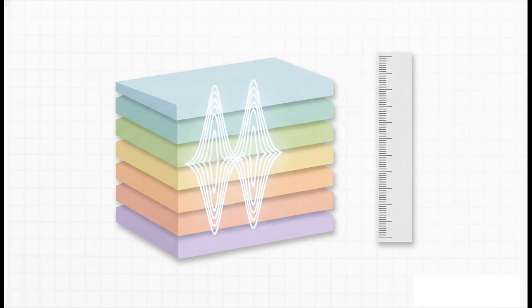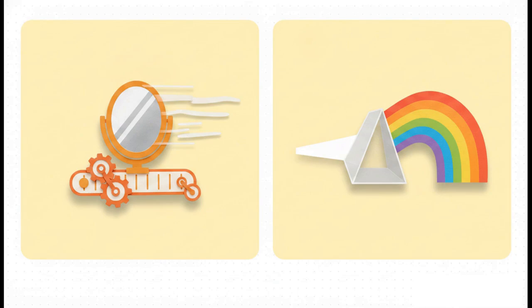Just for a bit of context, historically, older systems used what's called time-domain OCT. To make that work, the machine actually had to physically, mechanically move the reference mirror back and forth to find that exact matching depth for every single microscopic point. I mean, it worked, but it was incredibly slow.